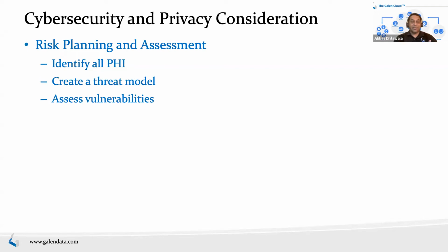Assessing vulnerabilities means identifying vulnerabilities that could lead to harm. If you're familiar with standard safety risk, think of these as, if you're doing FMEA, your faults. So what can go wrong, and what are the problems within your device? Is your authentication weak? How are you sending data? Is it encrypted? Is it not encrypted? Those kinds of things. You assess all the different vulnerabilities. Can somebody just get the data transmission and things like that?